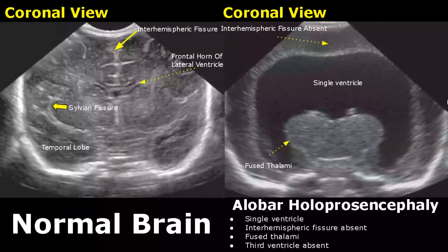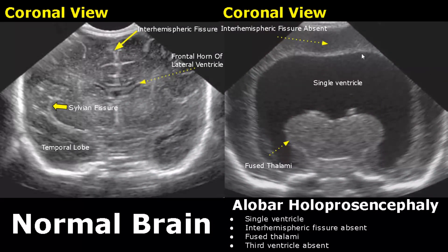Alobar holoprosencephaly is the most severe type. We will see a single large ventricle and fused thalami. The interhemispheric fissure is absent, the third ventricle is also absent, and there is a very small amount of brain tissue.